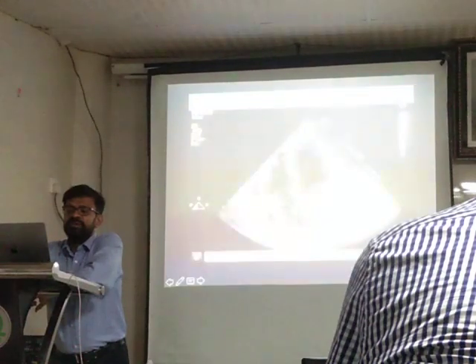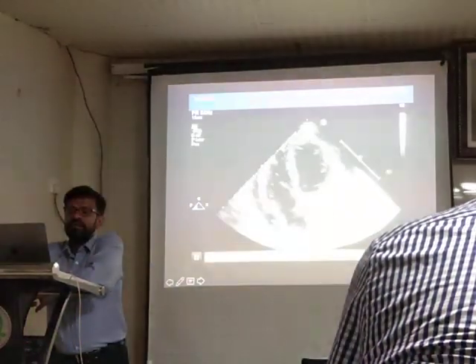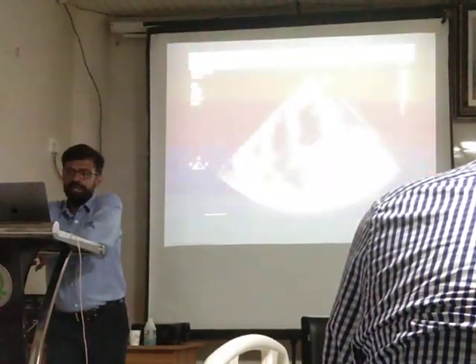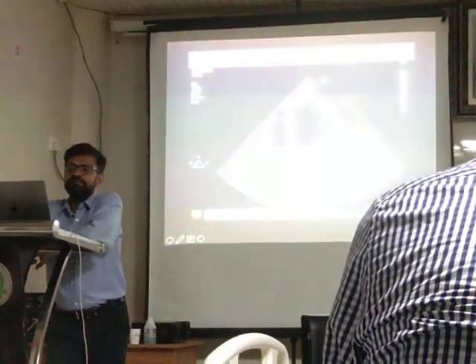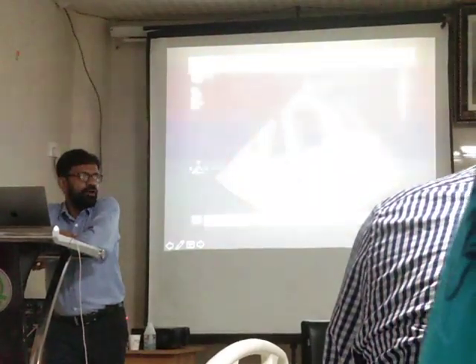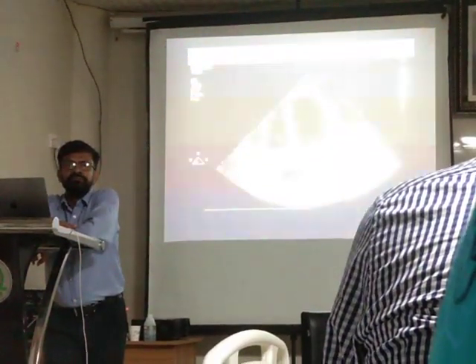So this is reverberation. This is not echo contrast. Right? And this is pericardial effusion. Can you see something dancing? This is a very dirty looking pointer. It is a pericardial effusion.